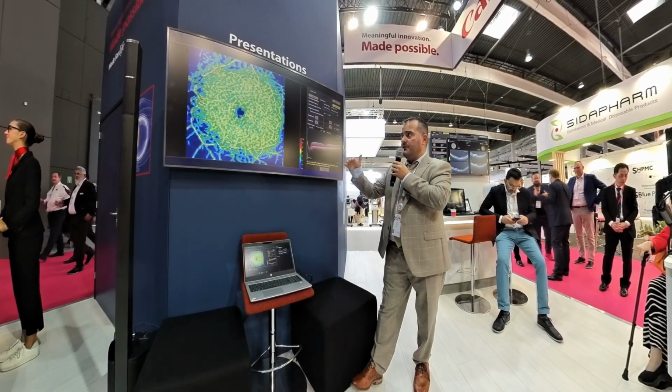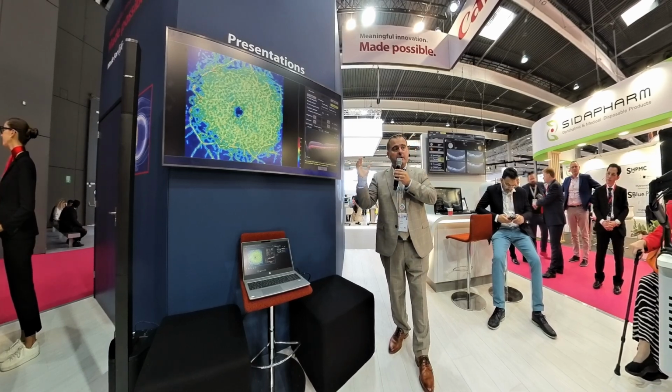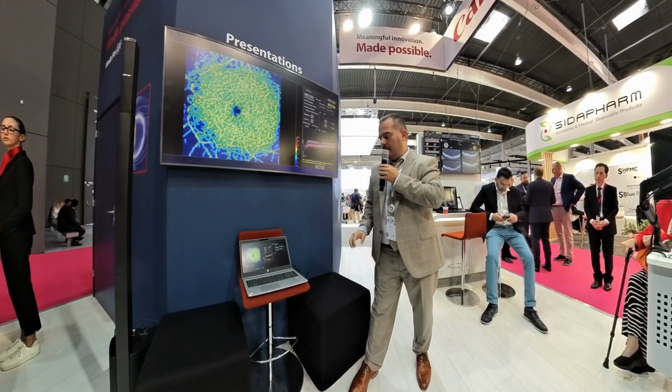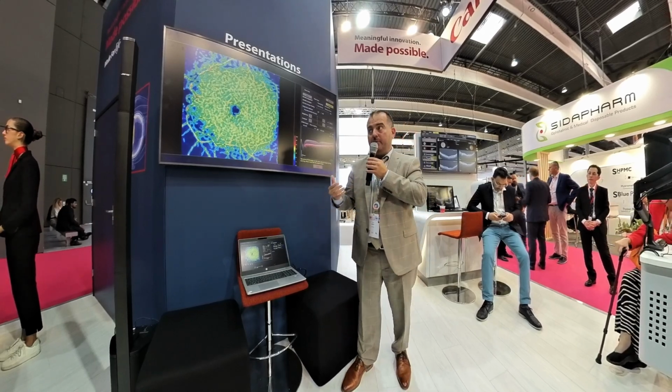And these are different types of depicting the result. Here is a color coding. Obviously, it's a false color coding, but it can pinpoint the area of the problem, which is more easily understandable for the patient.